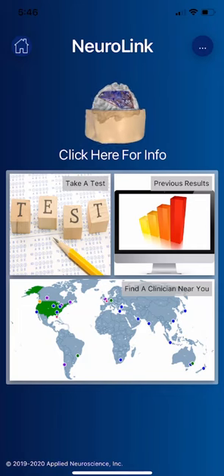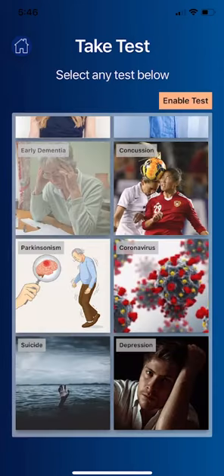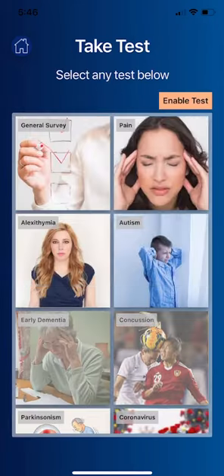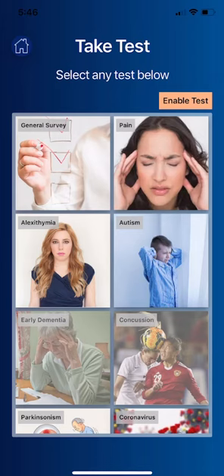Let's look at one of the tests. The first one is the general survey, which looks at a variety of different symptoms — from depression to anxiety, attention problems, and addiction, among others. I'll show that in a minute.